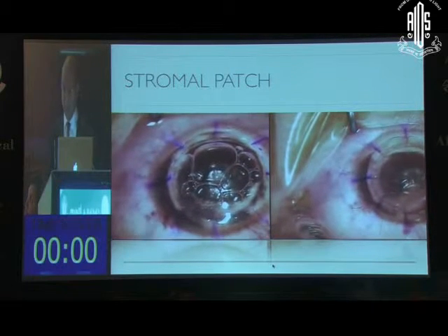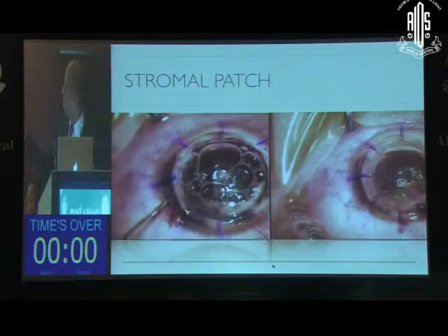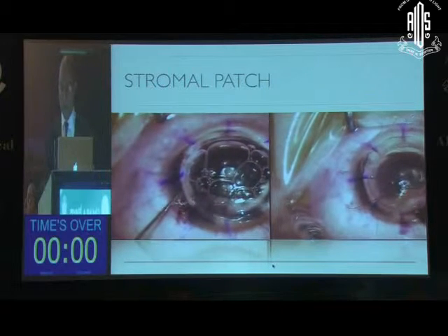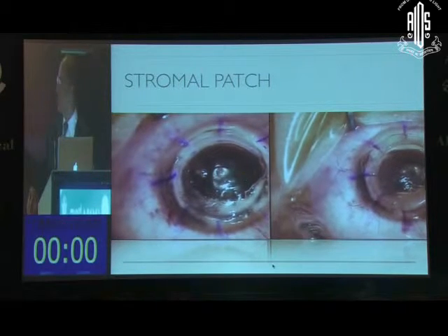And then after we put the button and put a few sutures, you can see in the right video, I actually pulled out that little patch. Luckily, the fibrin glue didn't hold so well, and I could tease it out. If it's eccentric, you could even leave that island there. Because it was in the center, I decided to remove it.